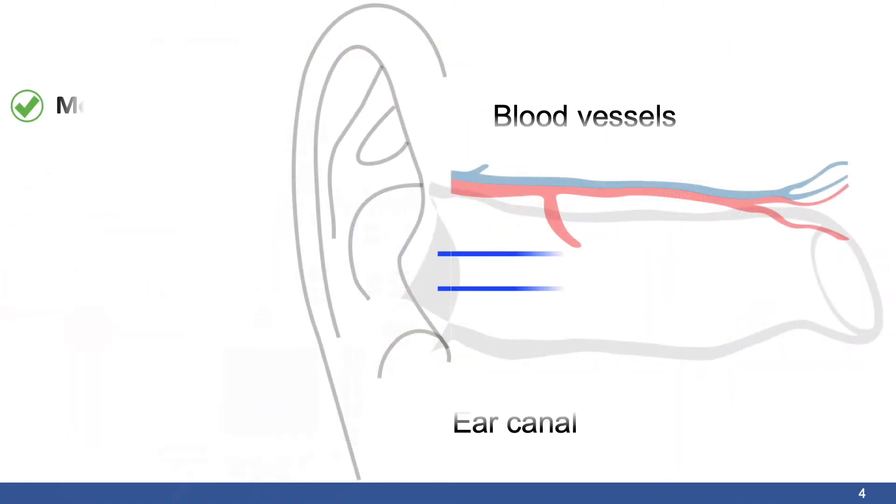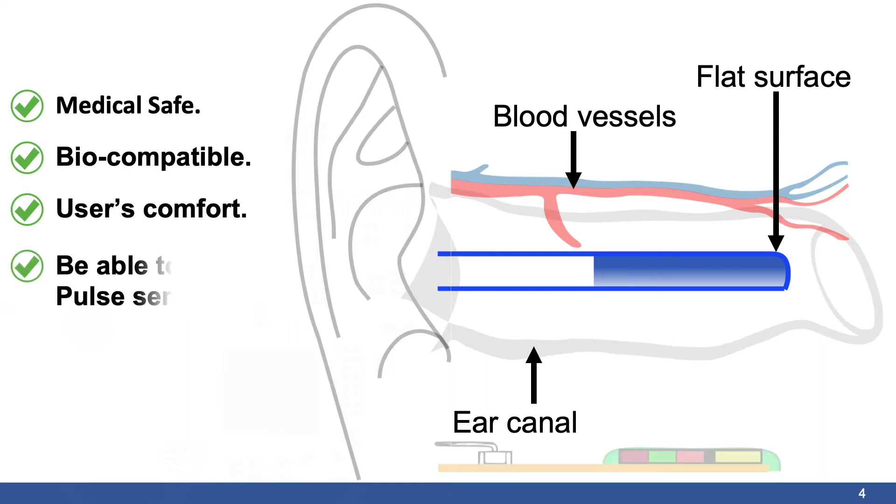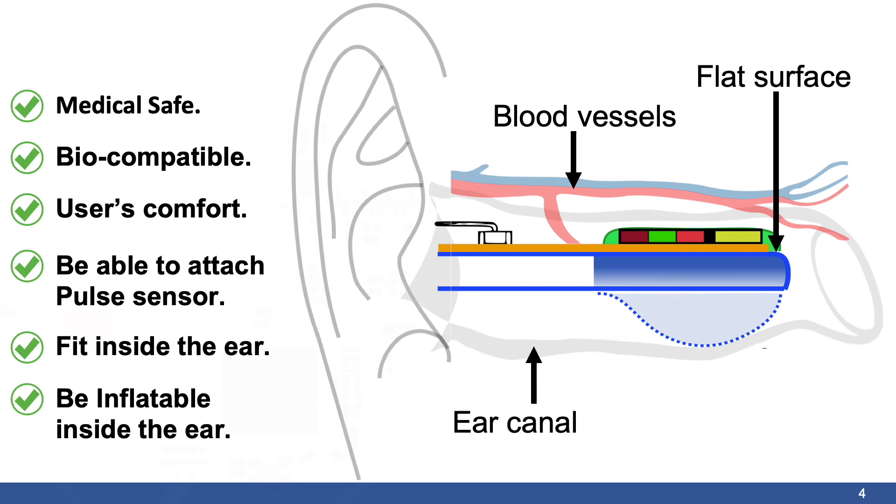The balloon is built with medically safe, biocompatible material and designed to give users comfort during measurements. A dedicated mechanical process is used to cure one side of the balloon so that the surface of that side stays flat during the inflation process. This allows us to securely attach the pulse sensor on the balloon while keeping it small enough to fit inside the ear.